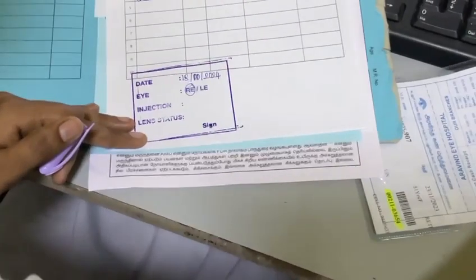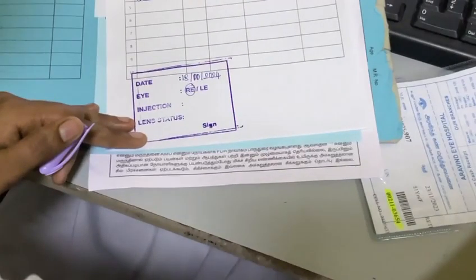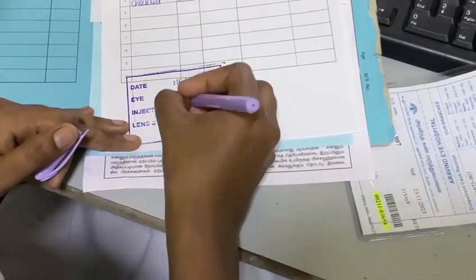Injection seal comprising details of the eye such as side, injection details, and lens status is stamped and filled.